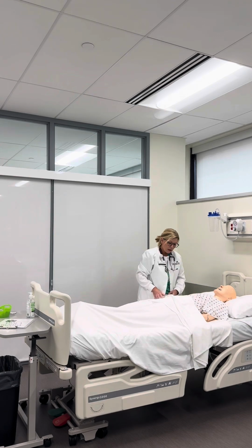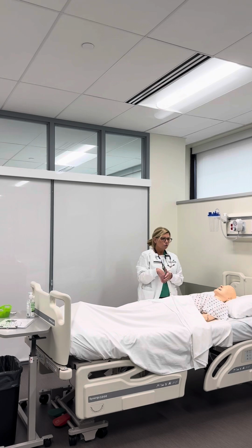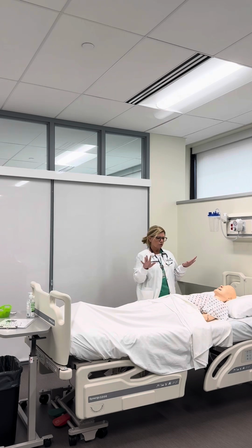So today I need to do an abdominal assessment on you, and then I also need to give you your medication through your G-tube. So do you have any questions before we start? No? Okay. So first I would get my vital signs, and I want to check the temperature, the pulse, the respirations, and the blood pressure. I want to ask my patient if they're having any pain. Are you having any pain today?